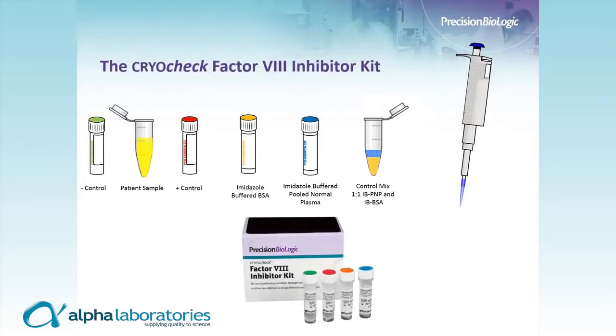I'd like to take just a couple of minutes to walk through this assay. As we all know, it's a long and complex assay, and I think it's helpful to see how these different components are addressed at the various stages.